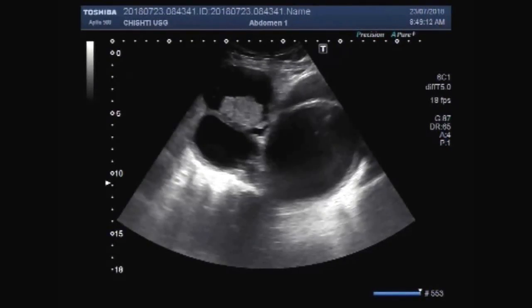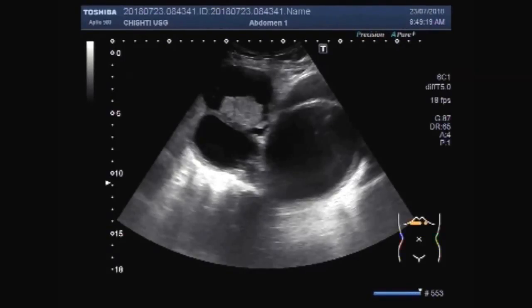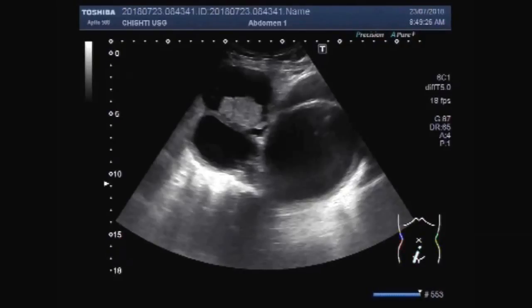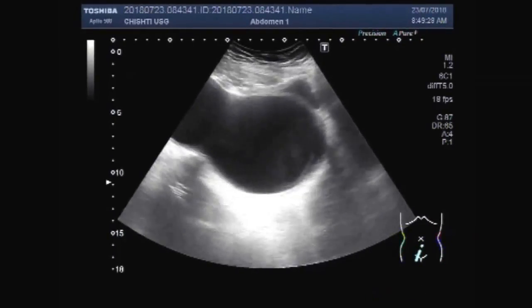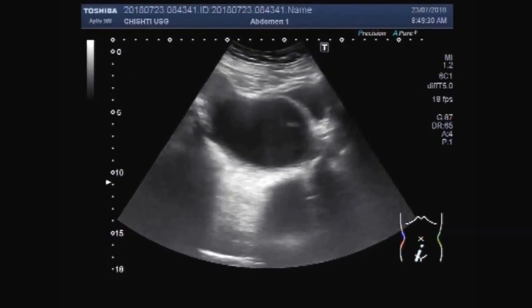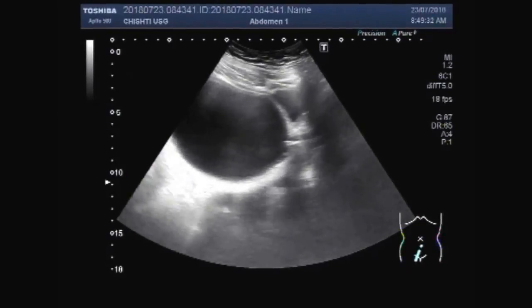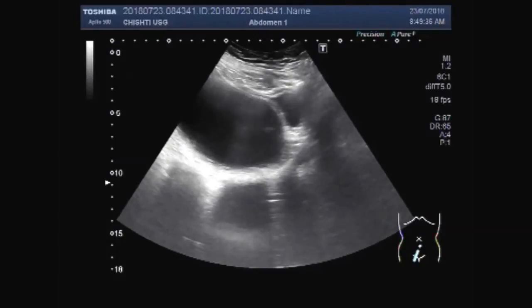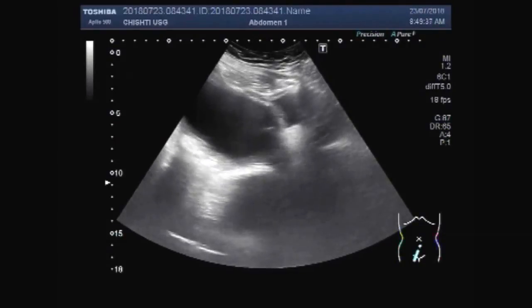Dear viewers, I hope you are all fine. This ultrasound video shows a bunch of multiple ovarian cysts lying adjacent to each other. A female patient of about 57 years old, having a bunch of multiple ovarian cysts. The cysts are quite large.